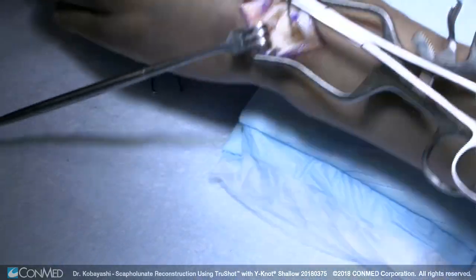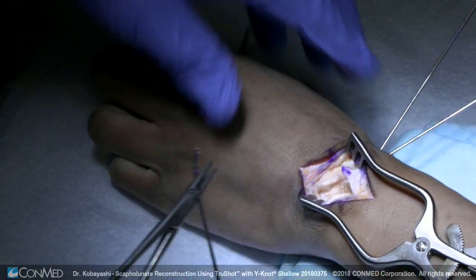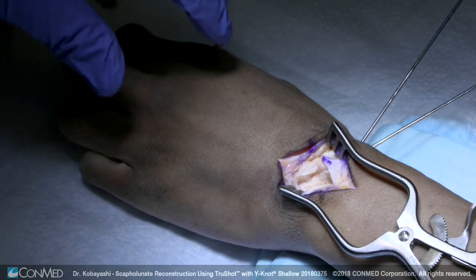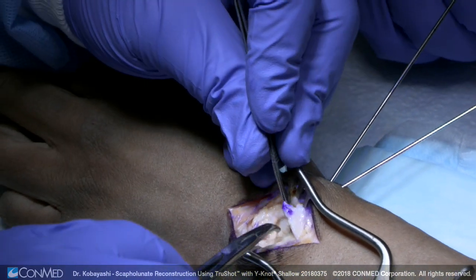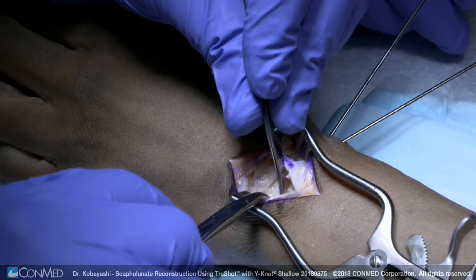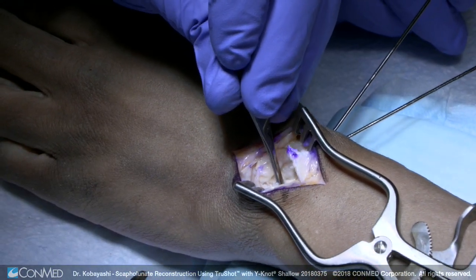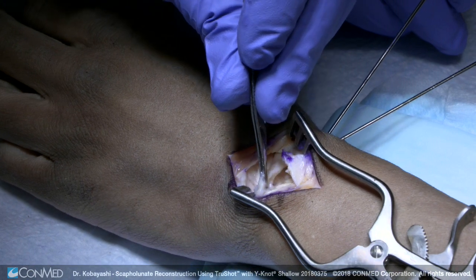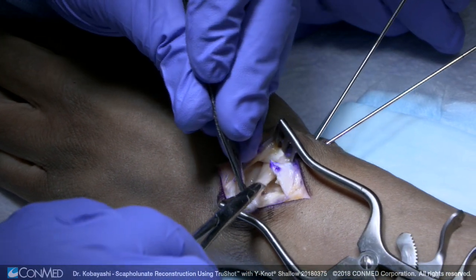Then we go back to the dorsal aspect of the wrist. These two K-wires here we can remove — your joints are reduced now. Here's the dorsal intercarpal ligament again. Here's our reduced scaphoid to lunate. You can barely see that space there, and then we're going to put our anchor right here. I also like to sew into this here too, to get a little more stability to prevent the scaphoid from rotating if you can sew into the dorsal radiocarpal ligament.